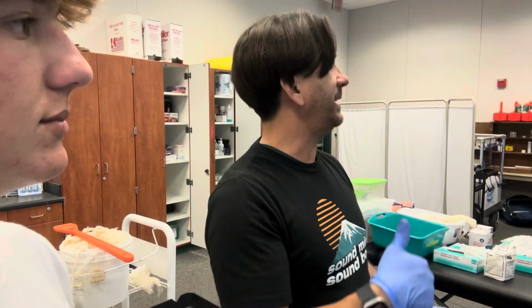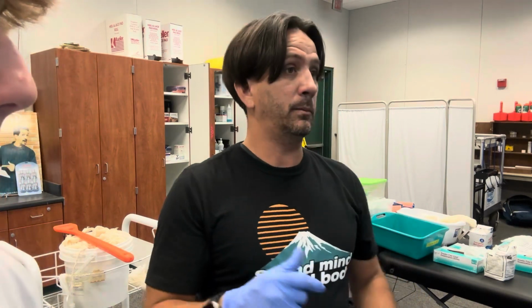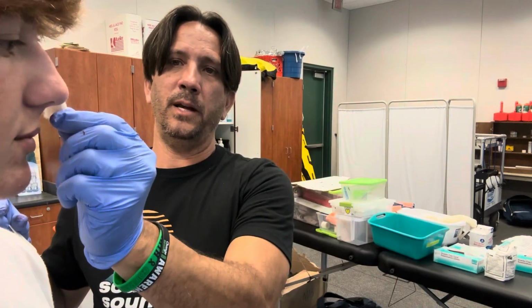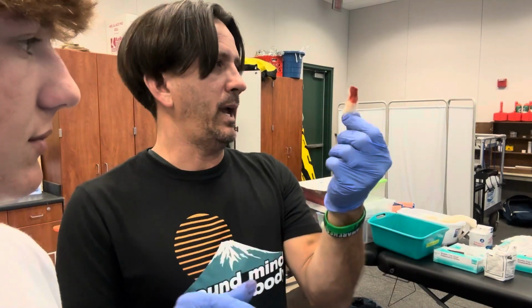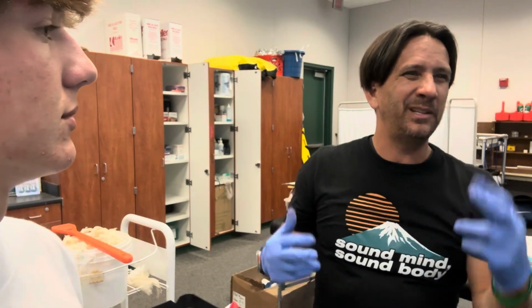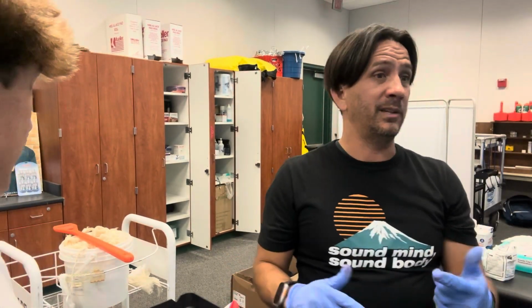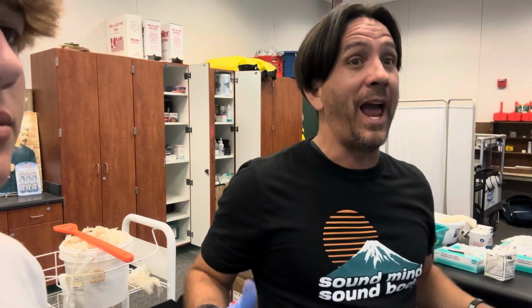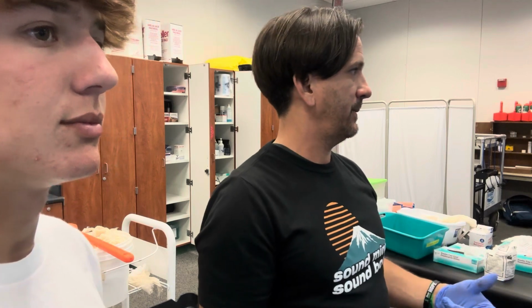Now, it might be that only one BleedCease is needed. You may put one in, and when you remove it, it's just a little red. That's all. You don't need to put a second one in because you've stopped the bleeding already. Then you'll clean them up. Always head forward. Most of the time, if the second one comes out, it's usually fine. But there are times when you pull the second one out and it's red and you have to put a third one in. So it just depends.